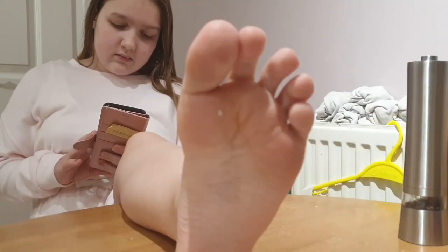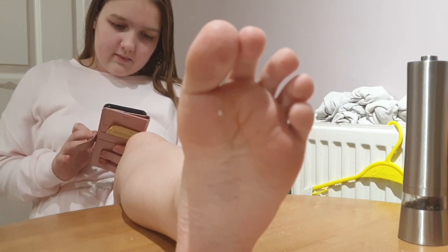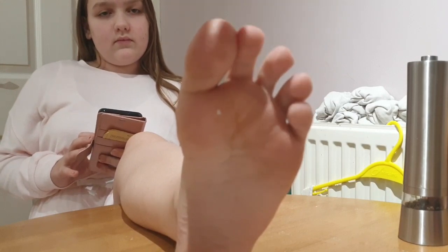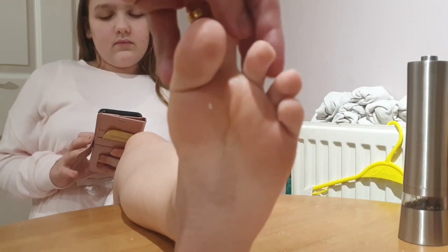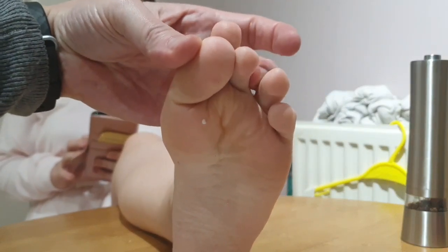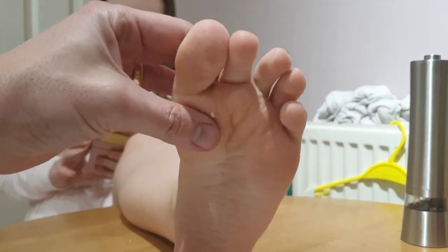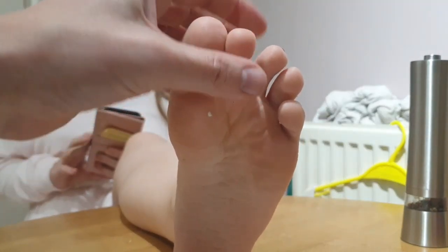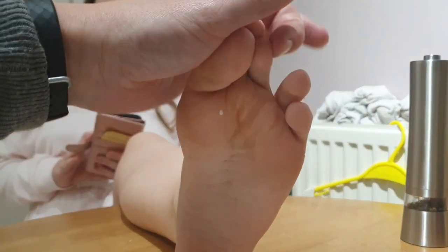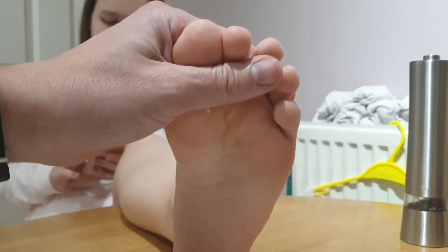The next one is something I call a socializer. It is designed for toes which either over or under ride. The significance of socializing is trying to keep everything all nice and close together, as opposed to having one lonely toe out there, unloved and rubbing on the shoe. So if we want to keep that toe in line with the others — this could apply with any toe, but it's usually the second toe which ends up overriding as the big toe comes across and the plantar plate fails.